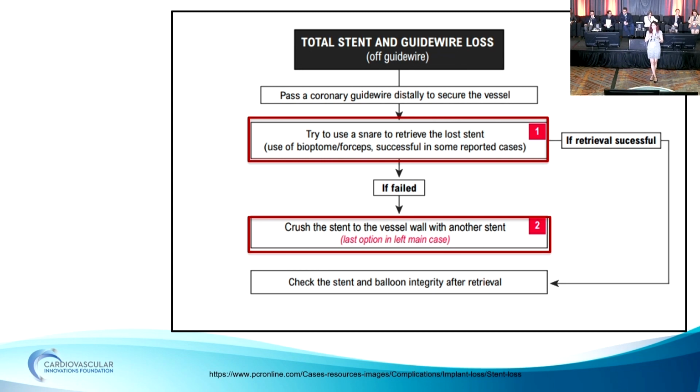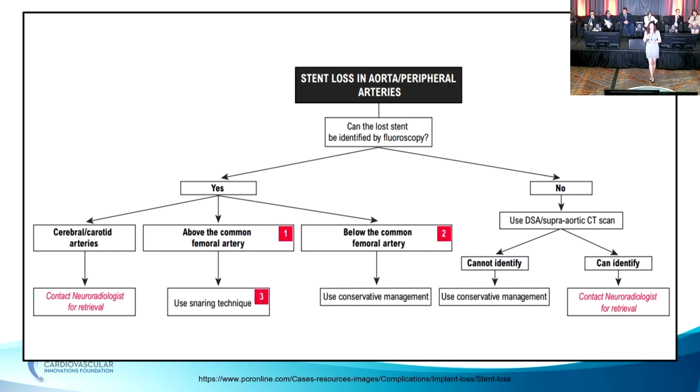Usually they advise not to do this if it's in the left main. You try it out, bring it out with the snare. You don't want so many layers within the left main.